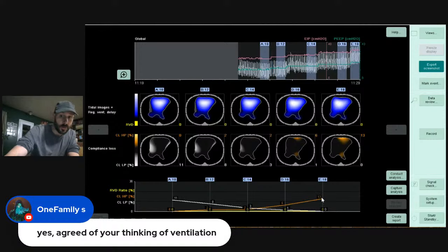It's like, well, what's the tidal volume? These are PEEPs, but what are the plateaus? So you're taking the global values that we have good science on, the ARDSNet, that's kind of outdated now, but overall higher PEEPs, smaller tidal volumes, minimize and lower your driving pressures. We use that. We don't throw that away, but then we can add all of this.